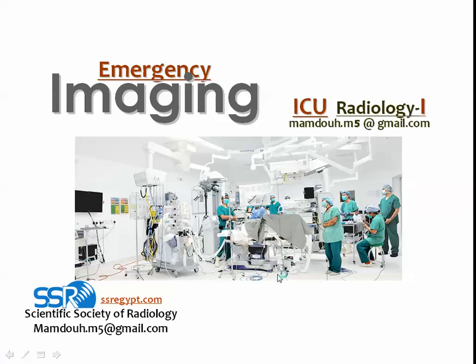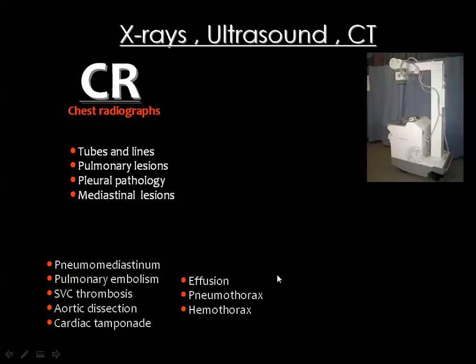And you know that we have three important imaging modalities for evaluation of ICU patients, and these are the X-rays, ultrasound, and the CT scan. Of course, the X-ray can be portable and can reach the patient in the ICU, and ultrasound is the same, it can be moved to the patient.